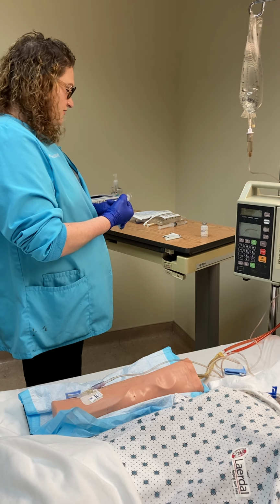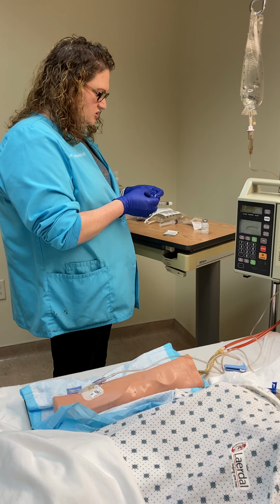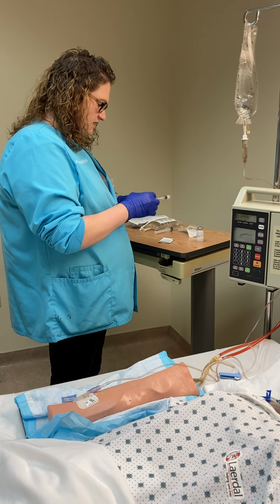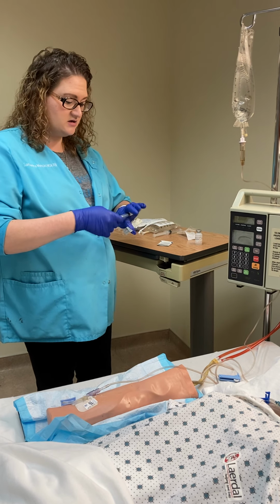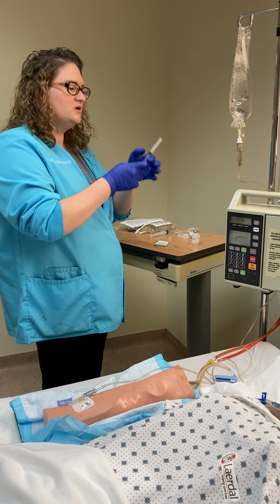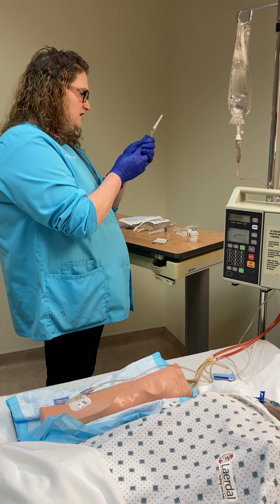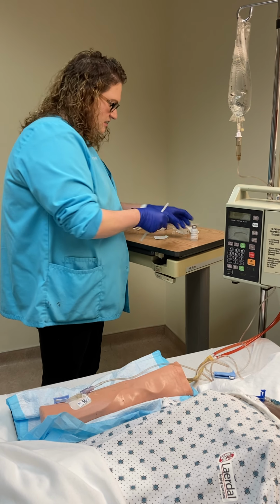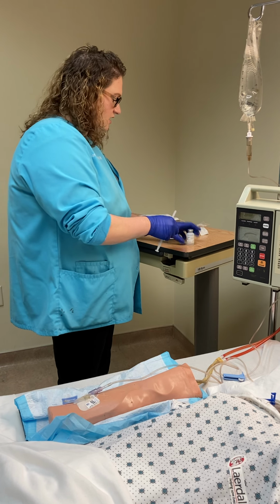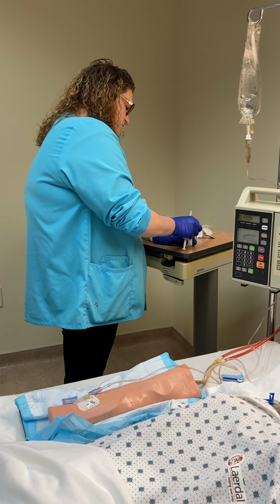So of course we would do our 3 checks, which we're looking at the name of the medication, the dosage, and also expiration date. We check that 3 times, once when we're taking it out of the Pyxis, the second when we are drawing it up, and the third one when we're at the patient's bedside. So I'm going to say I'm in the med room. I did 1 med check, and I do the second med check while I draw it up. If I'm preparing it outside of the patient's bedside, I need to make sure that I label it.